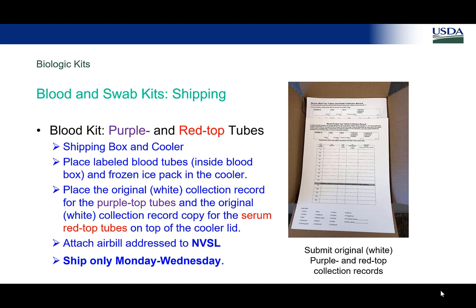So you'll send them all to KSBDL. It's all going to one lab. You go to one place. KSBDL will then forward them. Aren't they going to link all of the paperwork? So they're in a bag, and they're dry. They're dry swabs. Oh, okay. There's no culture media in them. That's the dry swabs.